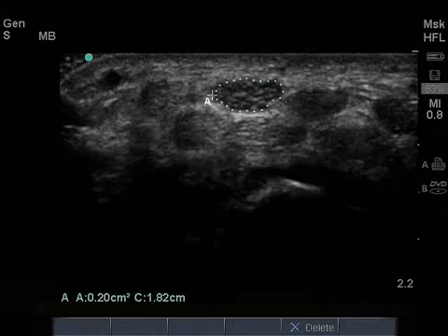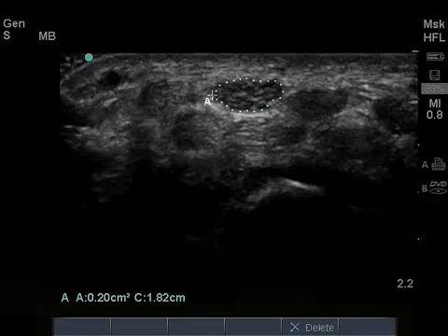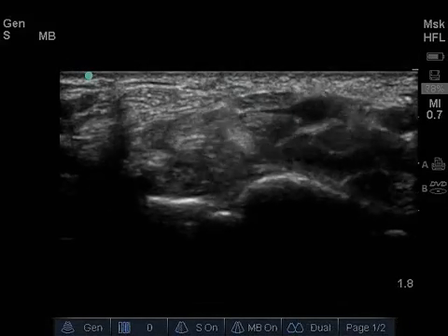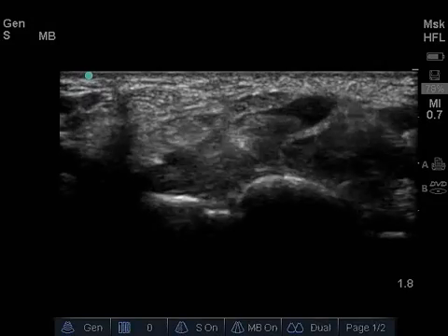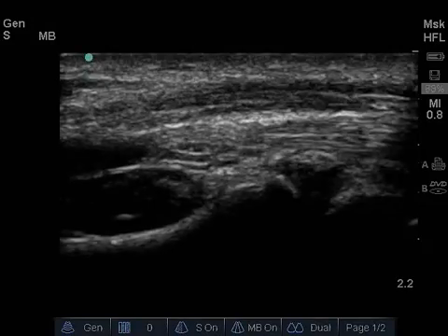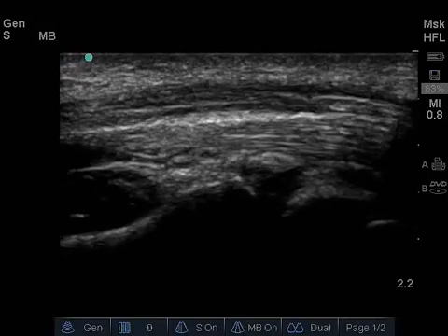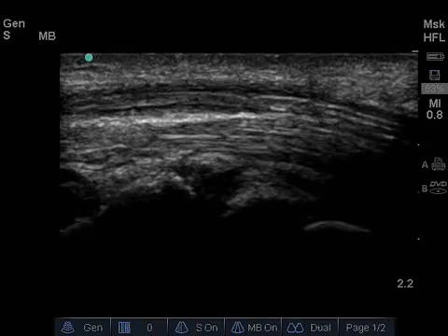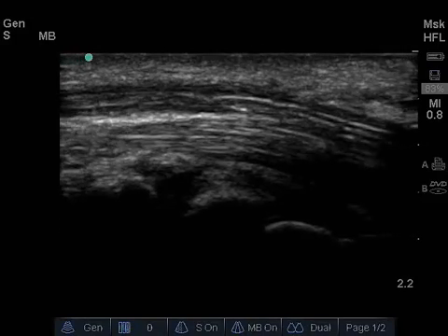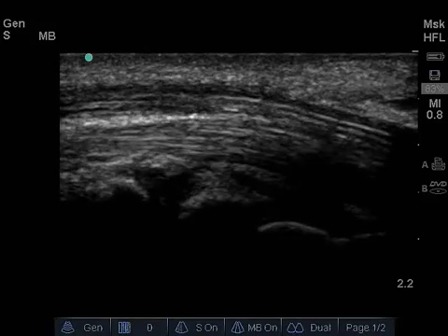A cross-sectional area greater than or equal to 10 mm square suggests carpal tunnel syndrome. Any enlargement of the median nerve at the carpal tunnel compared to more proximally, in the correct clinical setting, also suggests nerve compression. Physiologic transverse sliding of the median nerve with movement of the index finger may decrease with carpal tunnel syndrome. In the longitudinal plane, the median nerve will again appear swollen and hypoechoic, and may show an abrupt caliber change as it enters the proximal tunnel — a finding known as the notch sign.